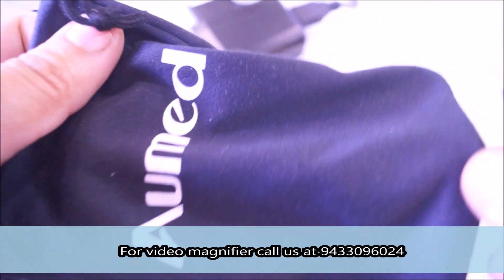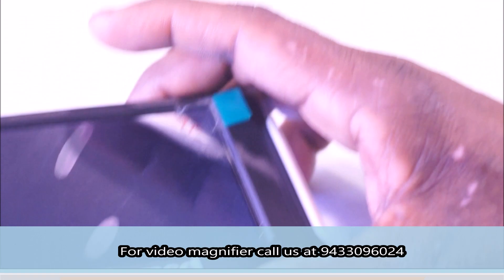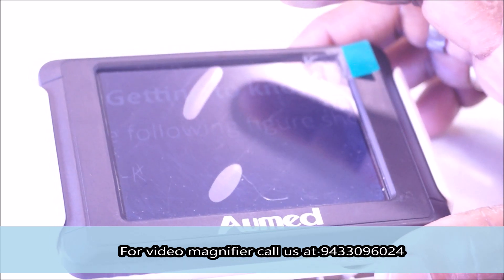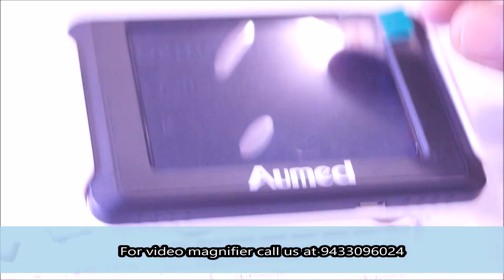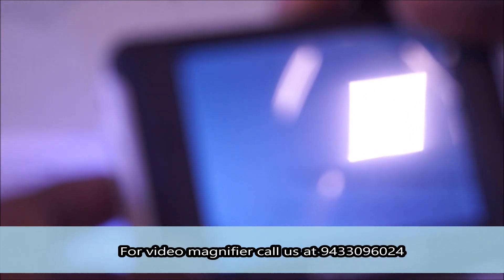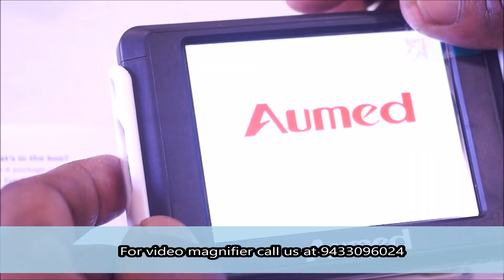Now let's have a demo of the patient and how he is using it. With us we have a patient who will tell us about his requirement. He wants to read a newspaper. He is asked how to start the machine, and he demonstrates switching it off and then switching it on again.